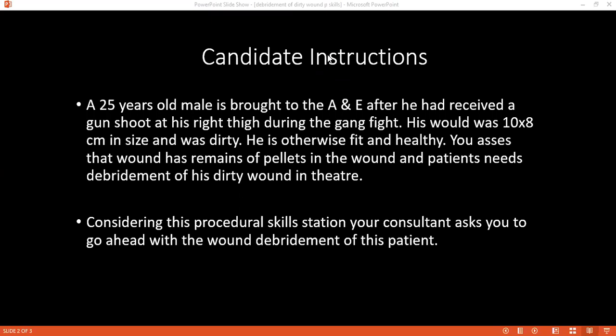Why? What are the low risks and what are the high risks that you can face? The low risk is that necrotic tissue may develop again in the wound, and I cannot see it. Pus formation can occur. The high risk is that it can lead to further spread of the infection, like necrotizing fasciitis and sepsis.